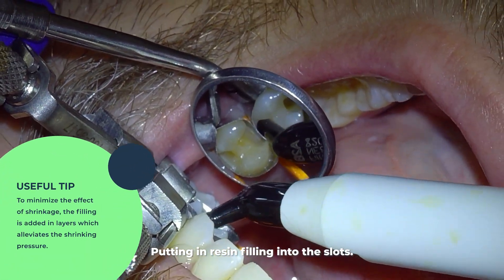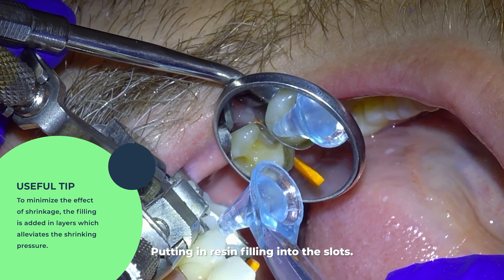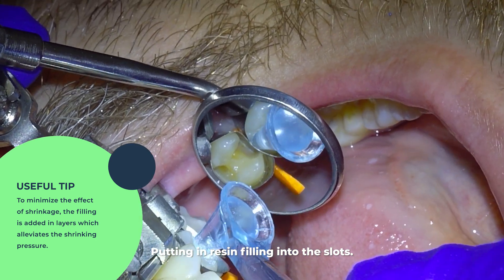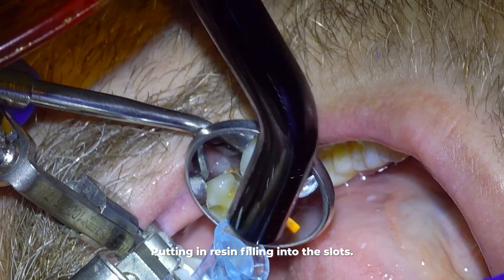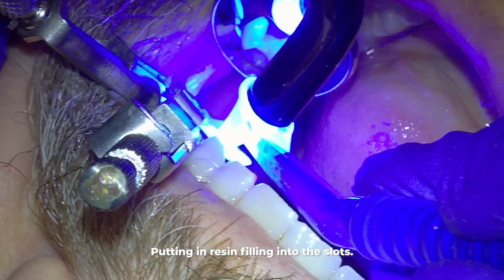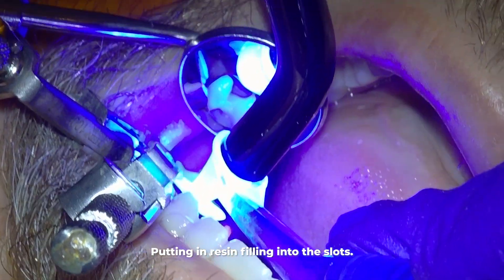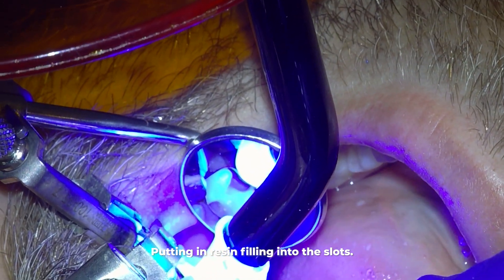To minimize the effects of shrinkage, the filling is added in layers, which alleviates the shrinking pressure put on the tooth. Right before I cure it, I press down with this blue filling-setting instrument, which pushes the filling material into all the crevices to minimize voids, and light travels through the instrument to set the filling.